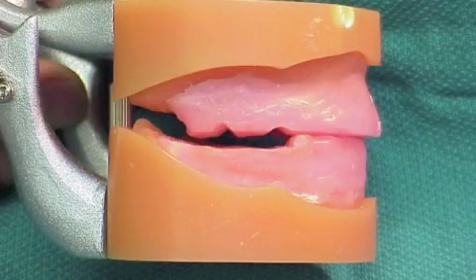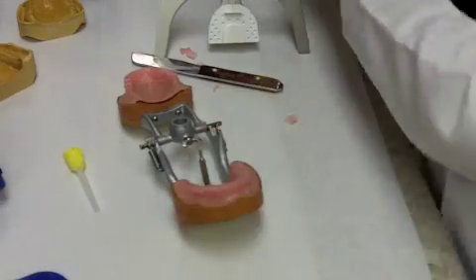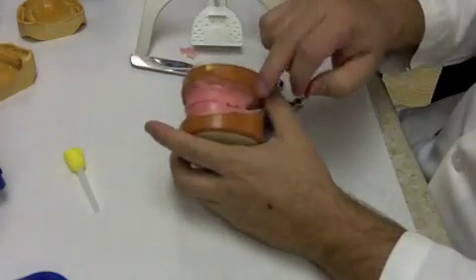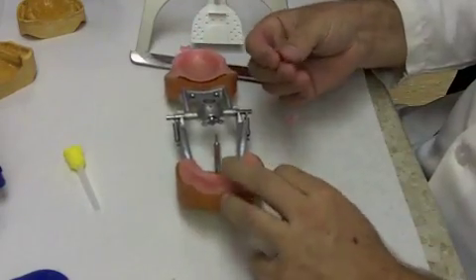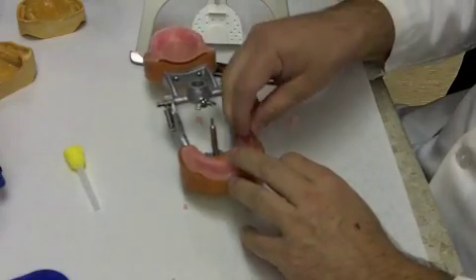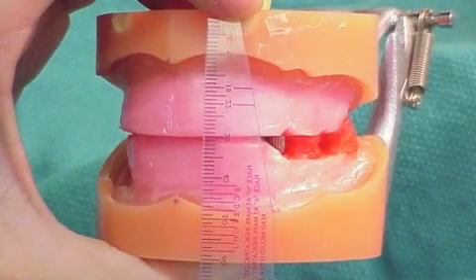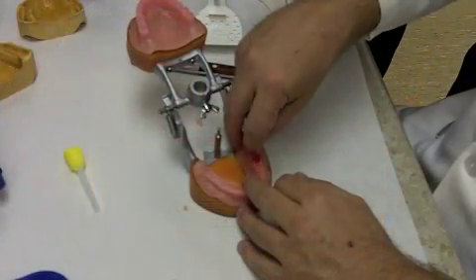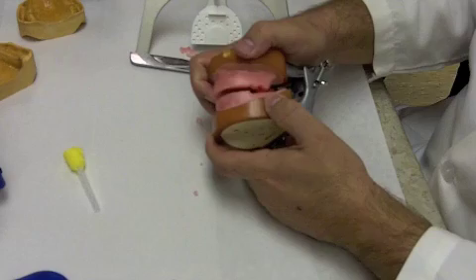So see here, we have a couple of notches on the maxilla, and we've cut away a little bit of the mandibular rim. Now the problem with doing this is whenever you've cut away that part of the mandibular rim, the patient may bite on that anterior segment and cause some kind of displacement of the posterior rim, either having the mandibular rim pop up or the maxillary rim pop down. So what we want to do is we want to add a couple of little red wax cones, and that helps us to maintain a little stop back there so that the patient will not cause displacement of either of the prosthesis.